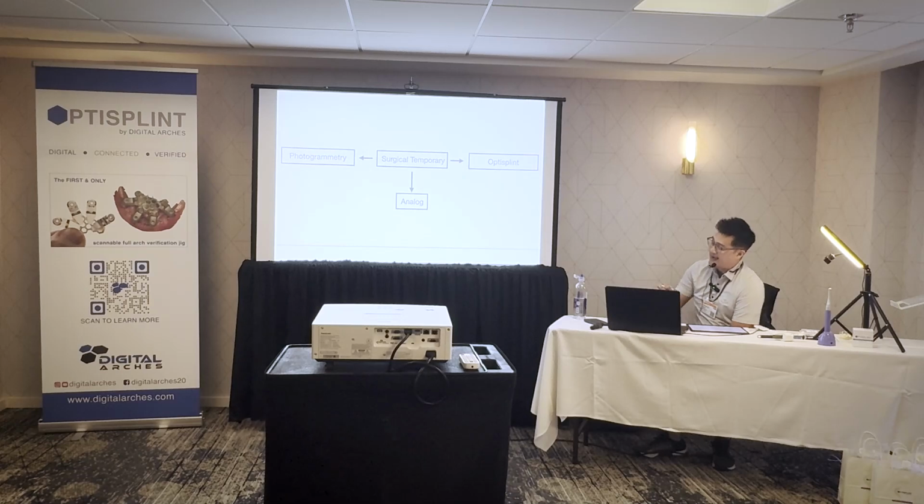So if I look at a surgical temporary, that means a case where either the dentist or the surgeon is going to scan the case, and I'm going to either design a prototype that they're going to print, or fabricate something that we deliver that day or the next day. That's a surgical temporary. How do these three modalities compare in terms of timing, pricing, startup costs, all those things?